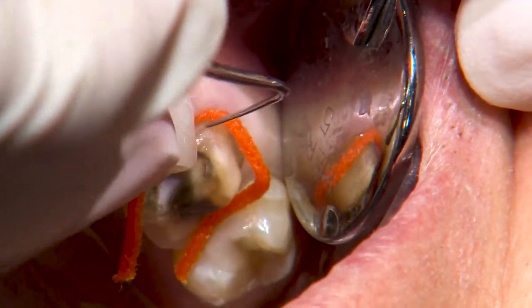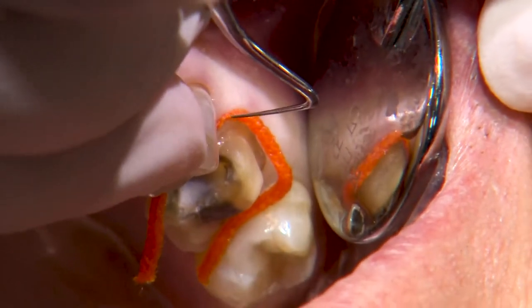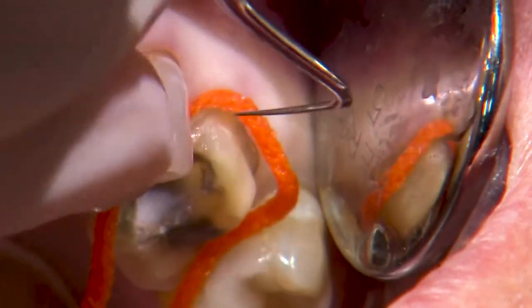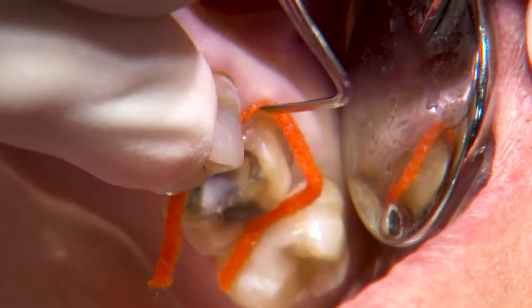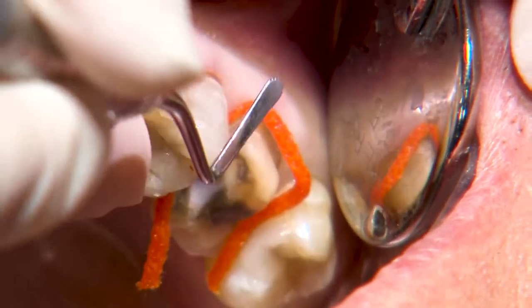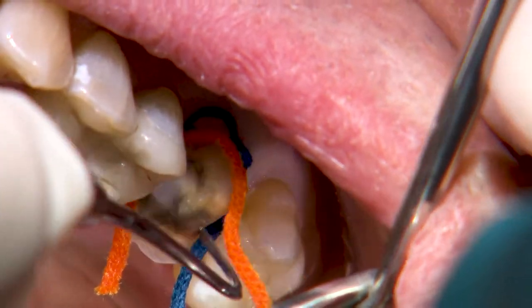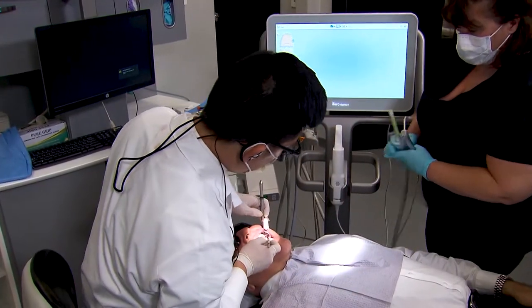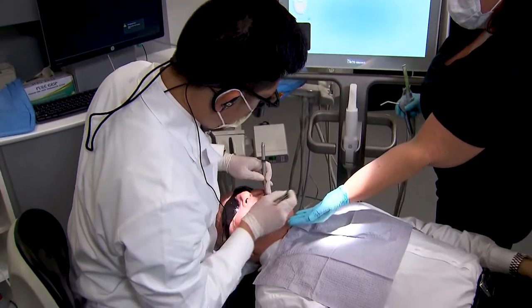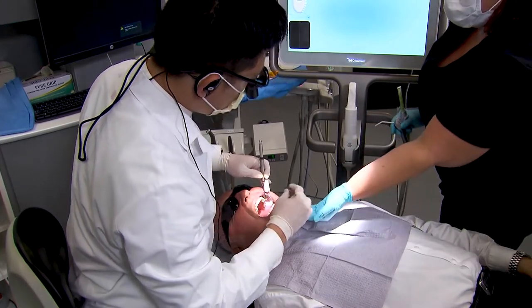If your margins are subgingival, some sort of gingival retraction must be used — otherwise, margin identification at best becomes a guesstimate. Here I'm using a single cord technique with a size one along the buccal and a size two on the mesial. I allow the cords to sit for at least five minutes, then gently pull the cords while they're wet right before I take the digital impression. I wet the cords and remove them gently to reduce the likelihood of any bleeding.